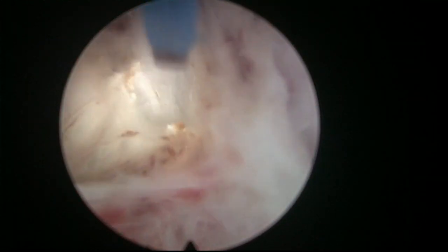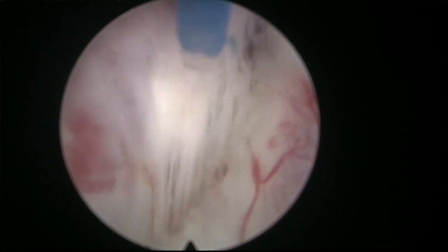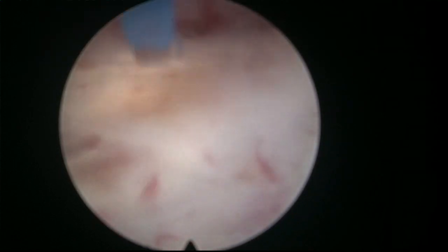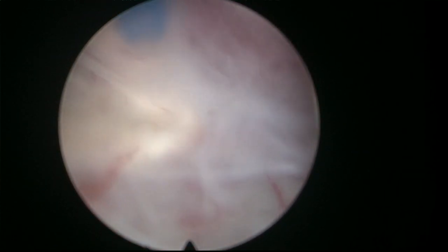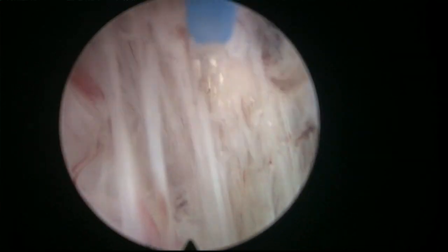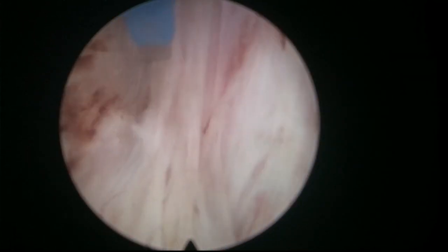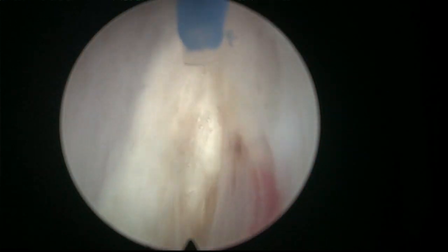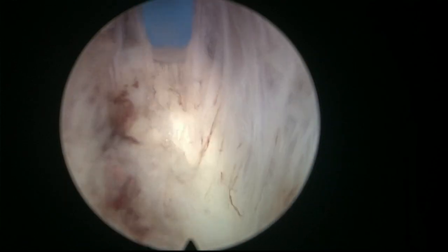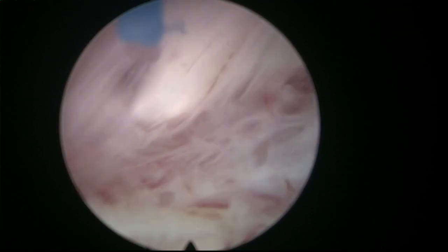Of course, you have to find a speed of dissection that provides you nice developing of the plane, but at the same time, nice hemostasis. You know, if you rush it too much, you can find that there are many bleeders going on at the same time, and then it might be difficult to establish hemostasis properly. It will take more time. You will regret that you did the dissection very fast. Sometimes you get carried away with how good the plane is and how the dissection is progressing, but then, of course, you leave too many small vessels at the same time, you know.